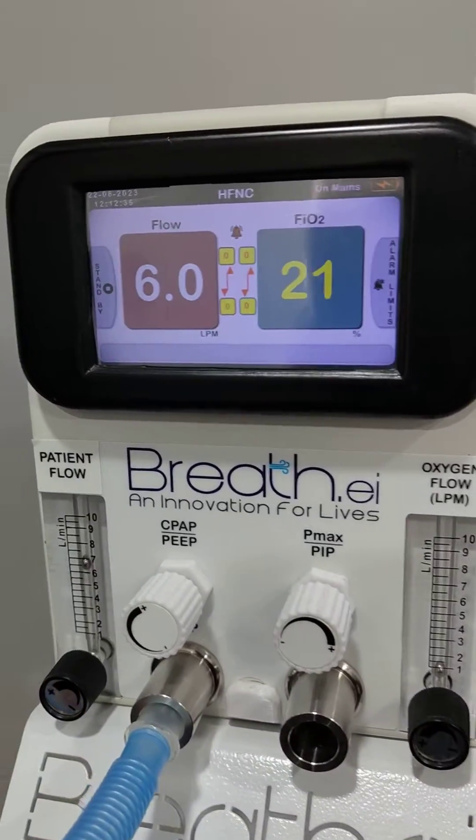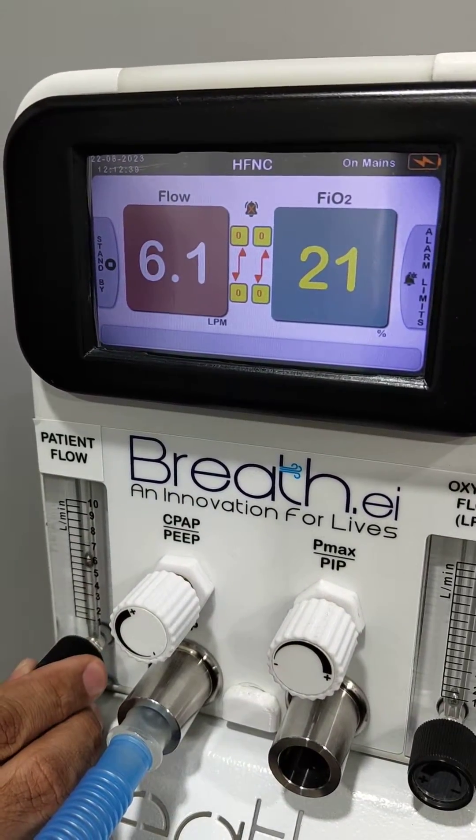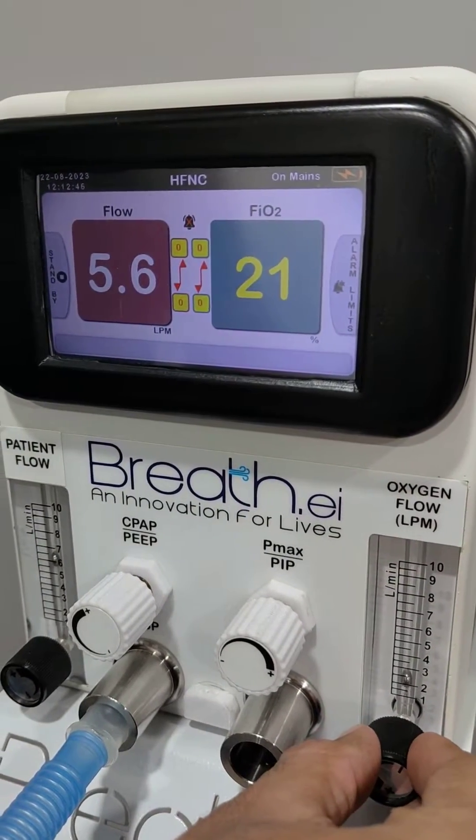In HFNC mode, we simply set the flow and we can control FiO2 from here. Only two parameters are required to set in HFNC mode.